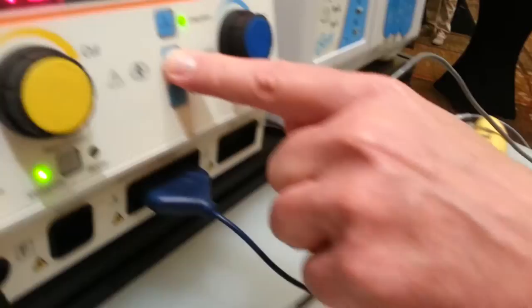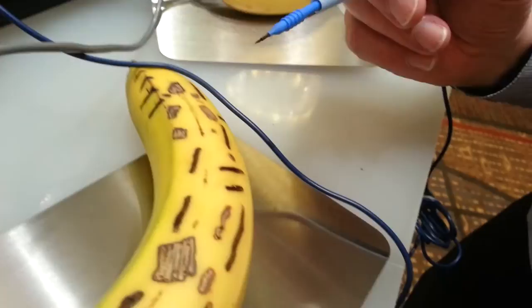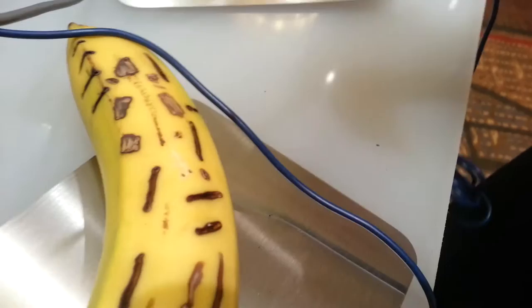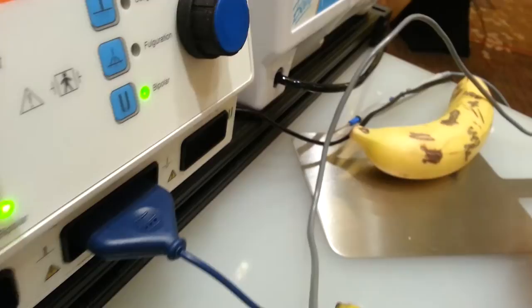Then I have my second coag function, fulguration. This is a light cauterizing, and how I do that is I come right above the surface of the tissue, and basically I do a painting style, and I'm allowed to dry out all the little bleeders.